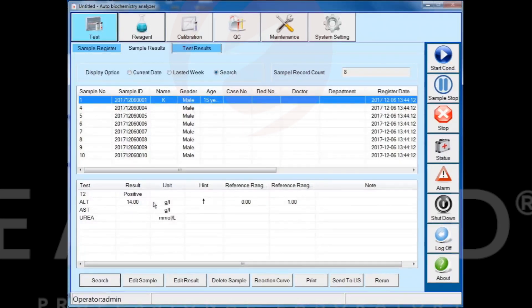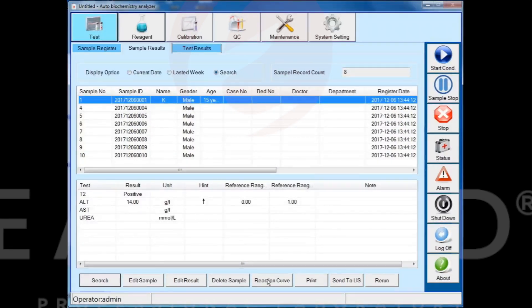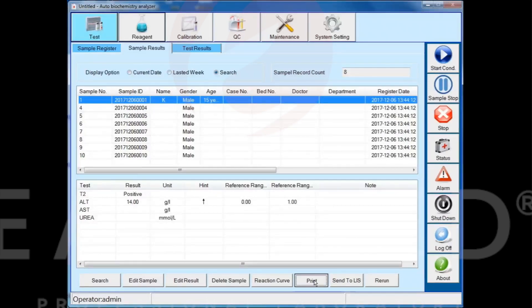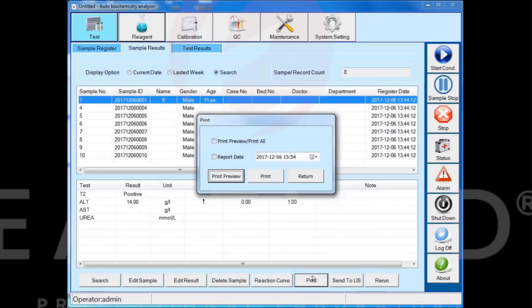Click the region curve button to view the reaction curve of the test item. Select one sample information, click the print button to preview and print the test result of the sample information.